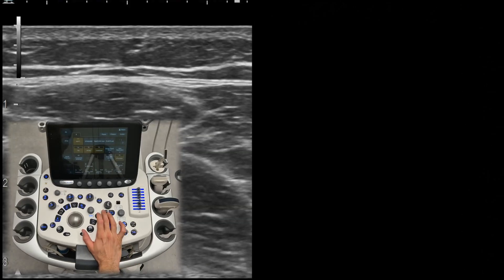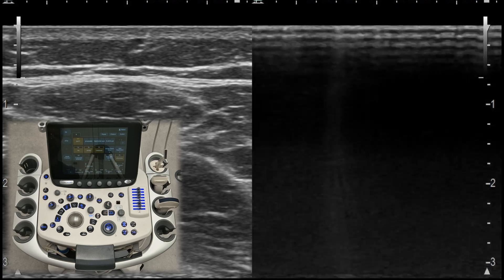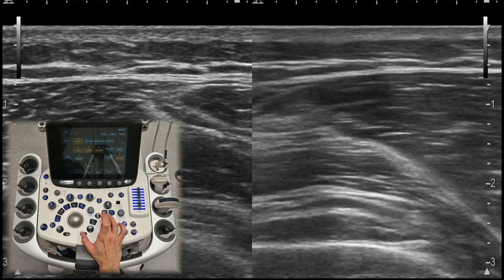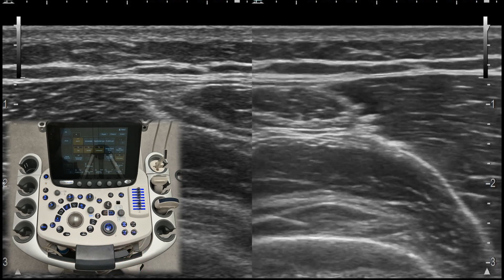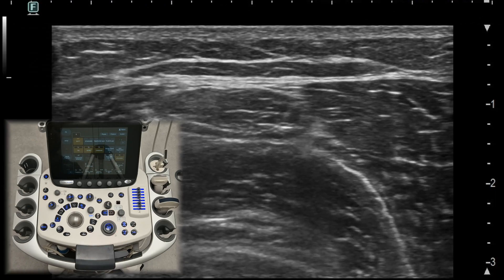Dual screen. The dual screen feature lets you view two images side by side. This is especially useful when you want to compare different views of the same structure or compare the injured side to the healthy one. You can also use the dual screen to create a bigger panoramic image by placing two images side by side. The single screen button is used to exit dual screen mode.